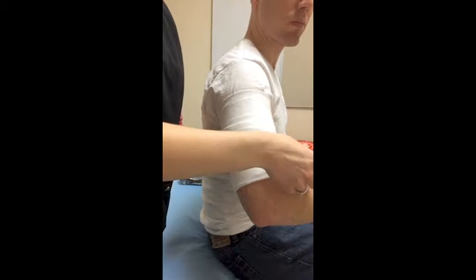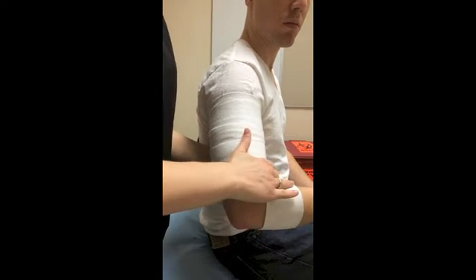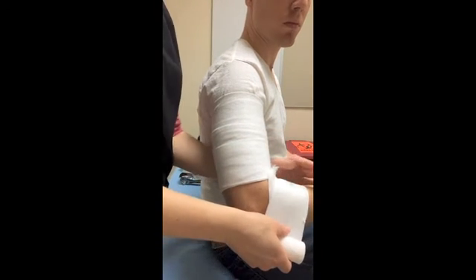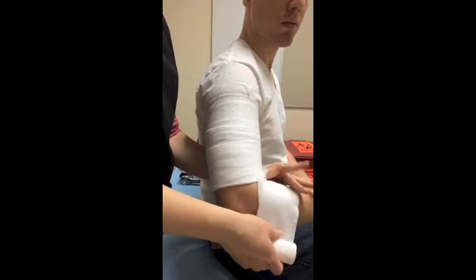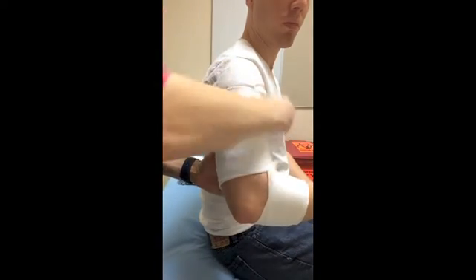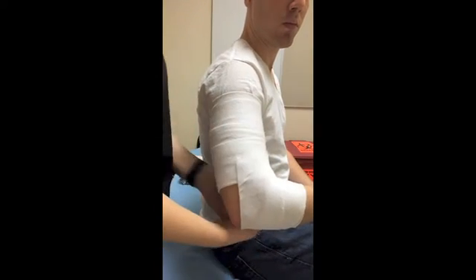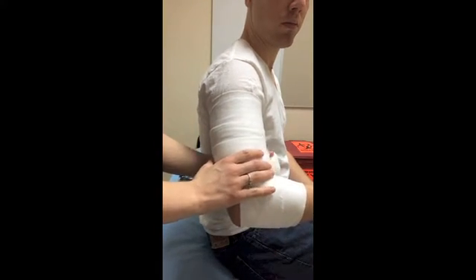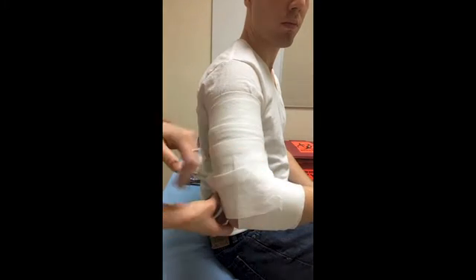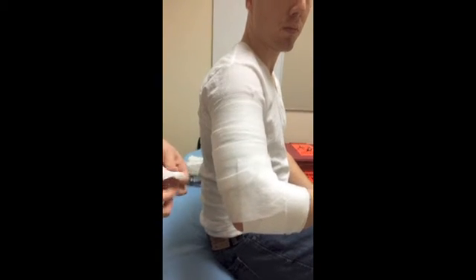And then we do want to get a little bit of lower arm padding, because this humeral coaptation is going to hold the arm at a 90-degree angle, which means we are going to have some contact with the splint down on this lower arm. We need to make sure that we get our 3 layers at least over the elbow. And then wherever the site of injury is, you may want to consider adding an extra few layers there just to give this patient plenty of protection since we're not using the stockinette as well.